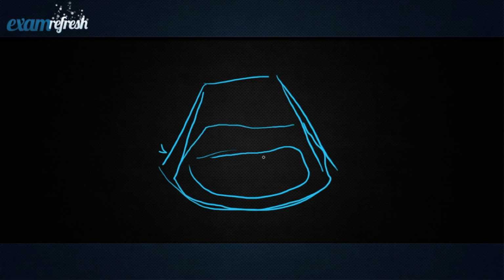So what does that have to do with temporal resolution? Well, as I'm scanning, if my temporal resolution is high, each of those images will be clearer than if it's not. So zoom in on the baby's kidney, get 1 focal zone in there, make the sector as narrow as possible, or actually zoom in on it, and then take your cine through it.